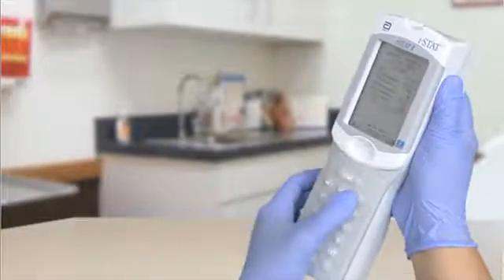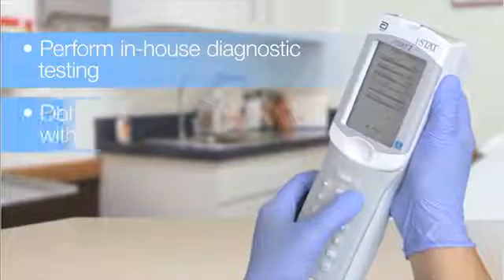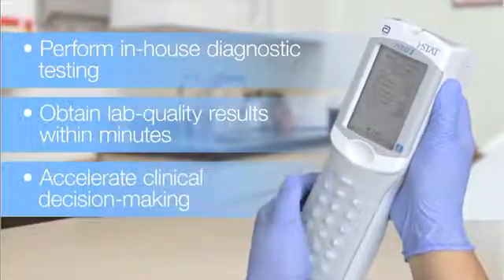With the iStat Analyzer, your facility can perform in-house diagnostic testing, obtain lab-quality results within minutes, and accelerate clinical decision-making.